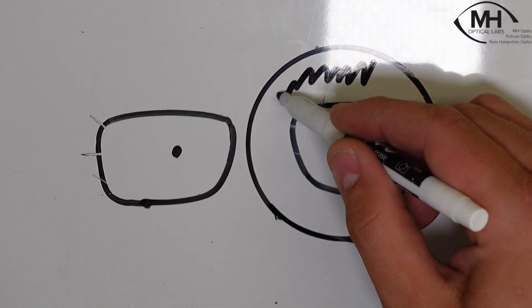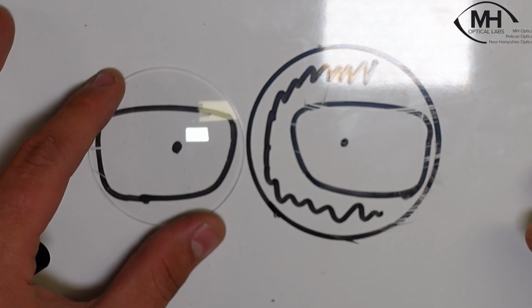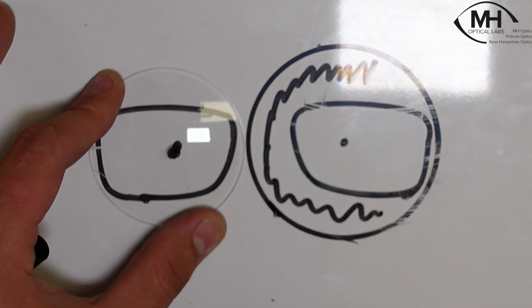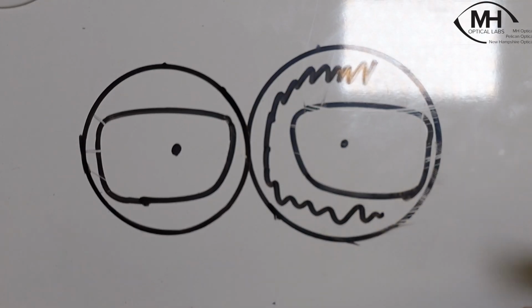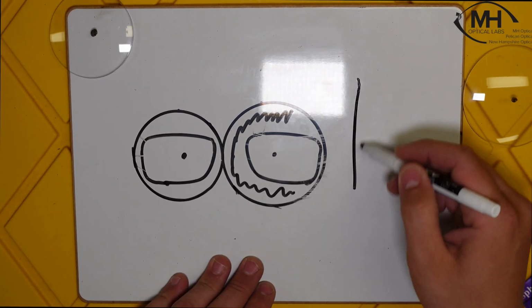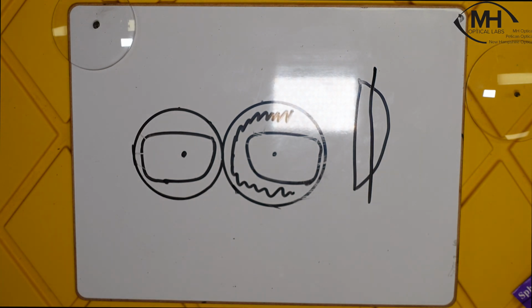Now look at all this waste. That's going to be really hard on our edgers and it's just not necessary. What we can do with a surface lens is take a much smaller blank, this is 10 millimeters smaller, and simply surface the lens and give us a much better cutout. Now we're not going to have nearly as much waste, and it's a better look overall, especially when it comes to plus lenses, because with plus lenses, the smaller the lens, the thinner the lens. So keep that in mind when using plus lenses. If you get the smallest blank possible, you're going to have a thinner lens.